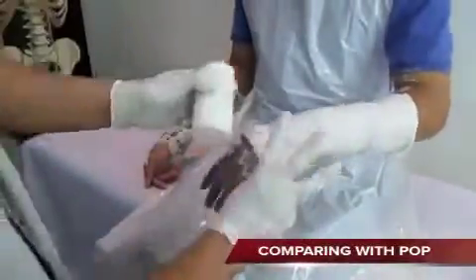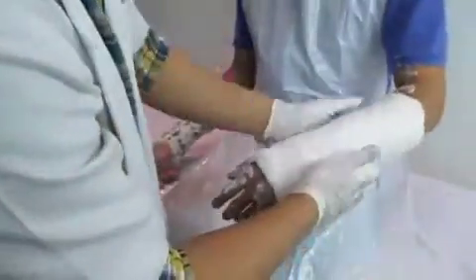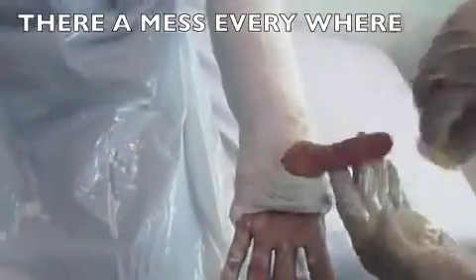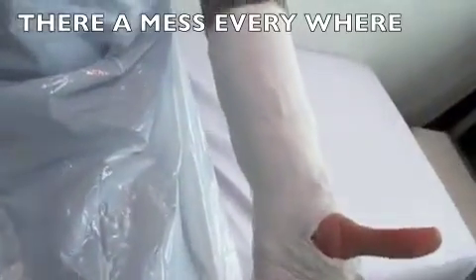Comparing with POP classic cast, we have to apply a very thick cast — 3, sometimes 4 layers if the patient is quite large — to make it more rigid. The other issue with POP cast is the mess everywhere that we have to clean up. This is very different from synthetic cast, and this is the advantage of synthetic cast.